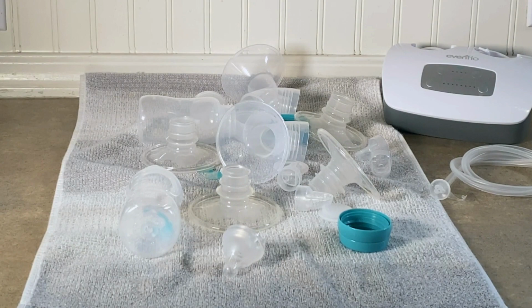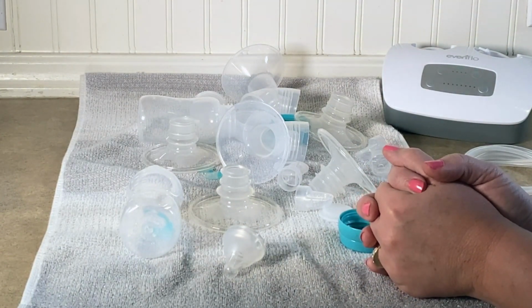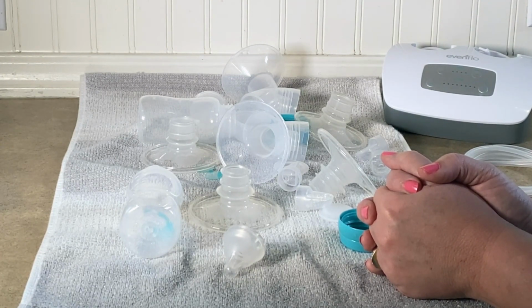After you've sanitized all of your pump pieces and everything is completely dry, it's time to put your pump back together. Before you touch anything, make sure you've washed your hands with soap and water. Alright, putting a pump back together is kind of like doing a jigsaw puzzle.